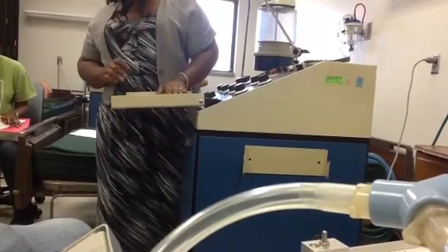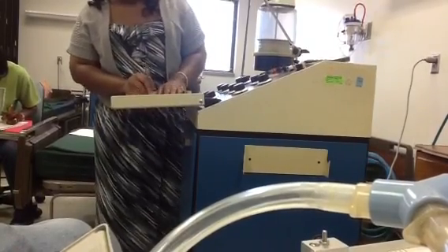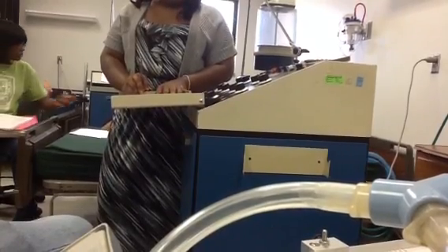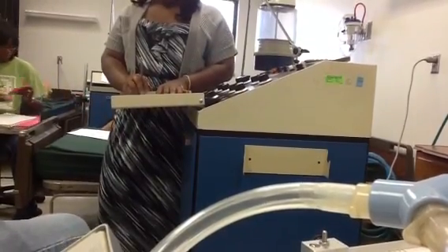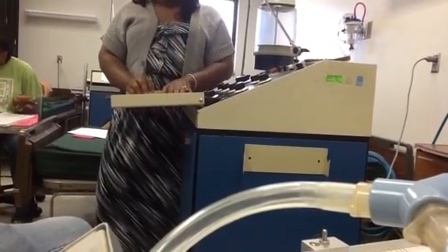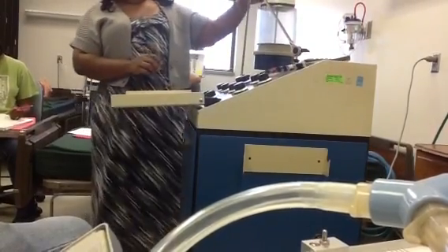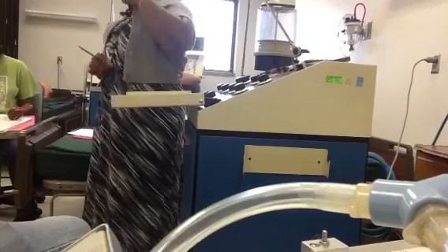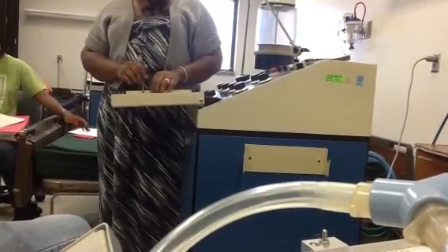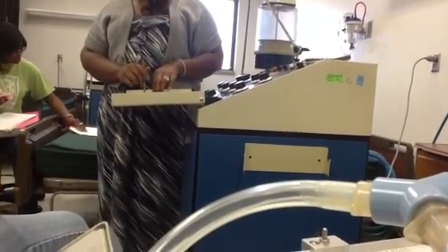Now you need to chart that tubing compliance factor that we calculated in the very beginning, so you should have it written down somewhere.